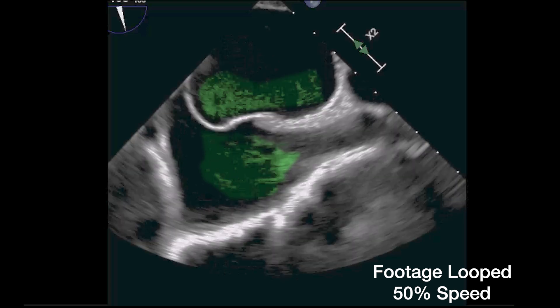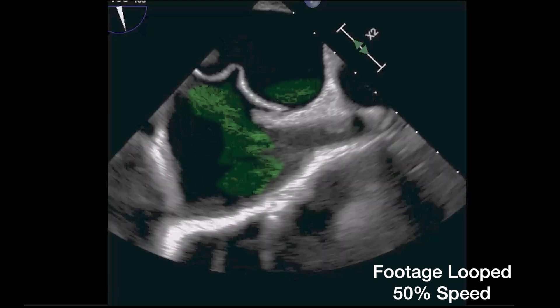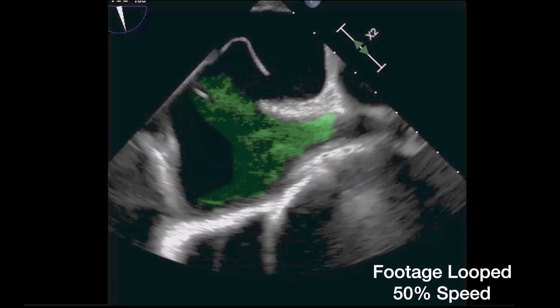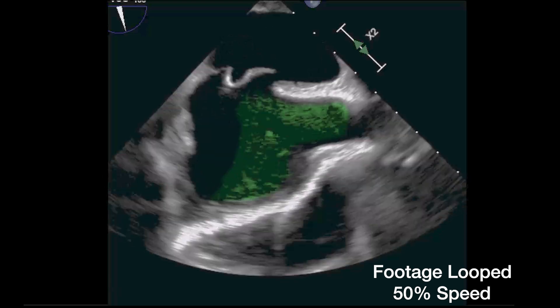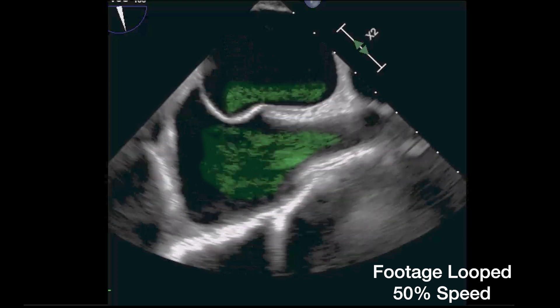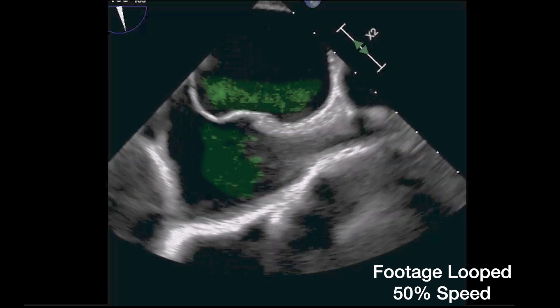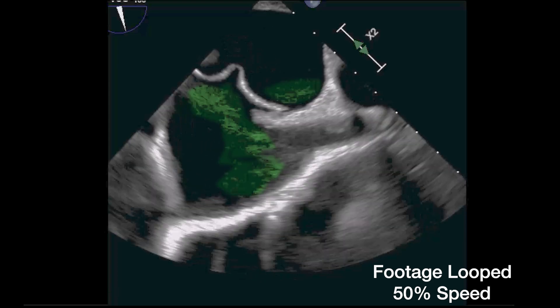Agitated saline from the right atrium, highlighted in green here, is shown to cross into the left atrium, which will appear within three cardiac cycles, making the diagnosis of a PFO.